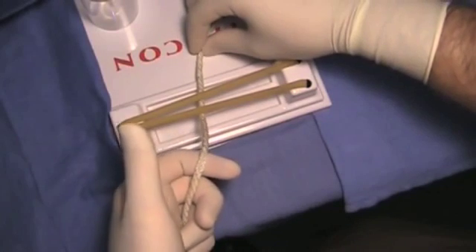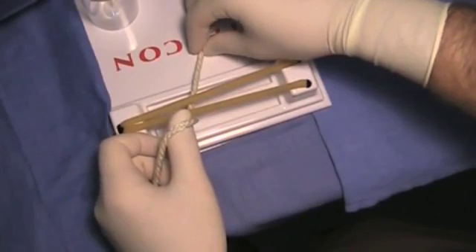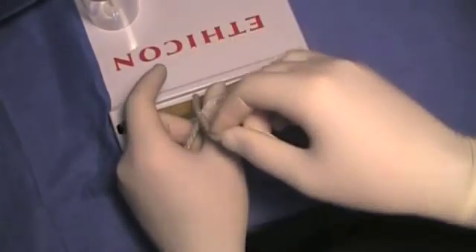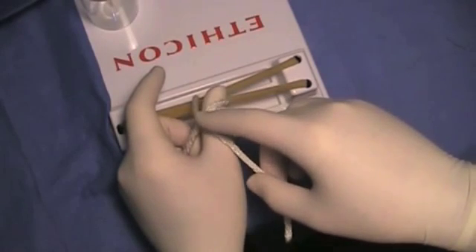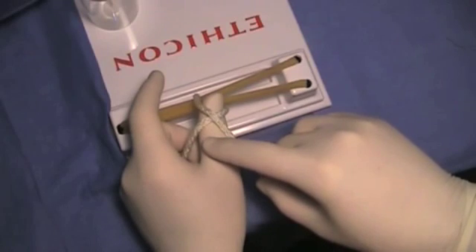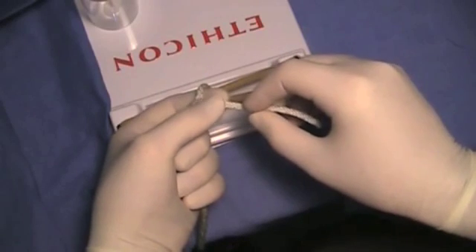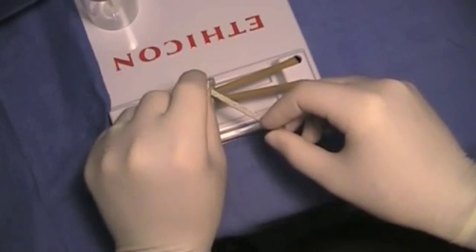Grab the left rope with the palm of your left hand. Drape the rope over the back of your thumb from right to left. Use the short end of the rope to drape over from left to right over the back of your thumb, creating an X. Then pinch your thumb and index finger together. Rotate your wrist or pinch fingers towards you. Release, pinch the short end, and rotate away from you so the short end goes through the loop away from you.